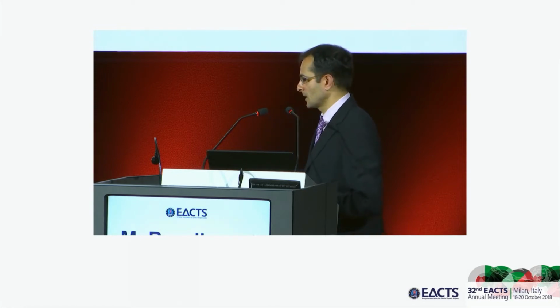So to sum it up, we've learned that valve-sparing root replacement reimplantation provides us with a very stable and durable result in terms of annuloplasty. So to the extent possible, I try to use the same guides as I would in a reimplantation procedure for choice of the prosthetic. Okay, thank you very much.